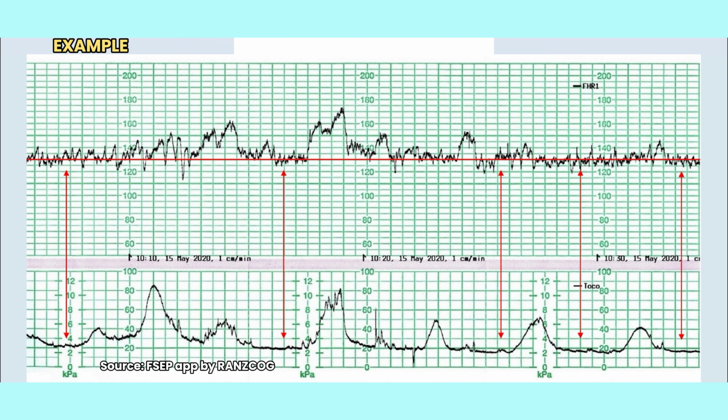Now let's look at a CTG together and use Dr. C BRAVADO to interpret this CTG. For example, this woman comes in labor and she has preeclampsia during this pregnancy. So now we can say that DR, determine the risk, is preeclampsia. She's having preeclampsia, that's why she needs this CTG monitoring.